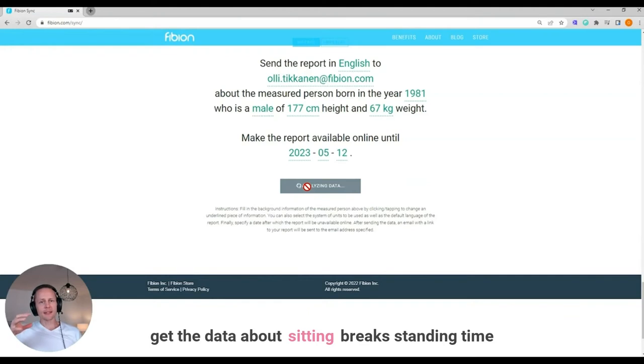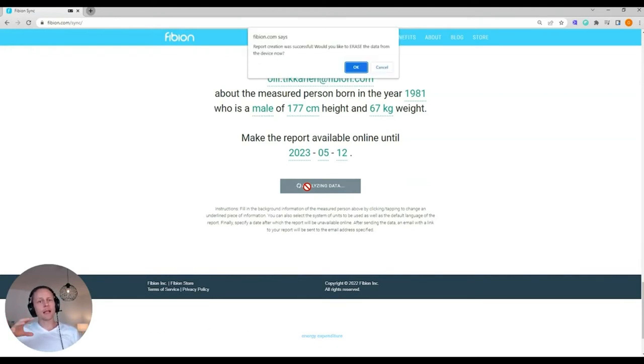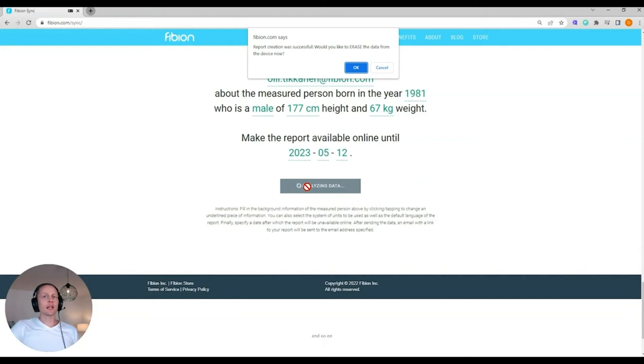about sitting, sitting breaks, standing time, energy expenditure and so on.